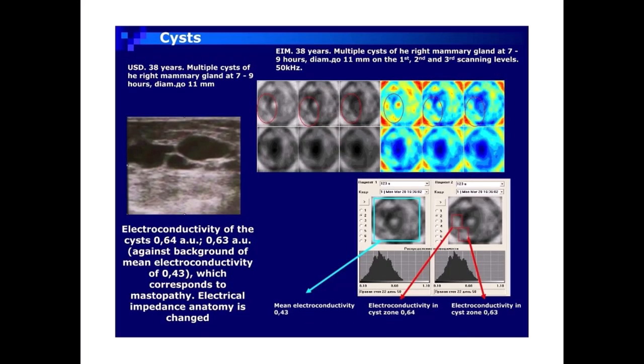Cysts EIM case: 38 years. Multiple cysts of the right mammary gland at 7–9 hours, Di-AM 11 mm, shown on the first, second, and third scanning levels at 50 kHz. Ultrasound: 38 years, multiple cysts of the right mammary gland at 7–9 hours, Di-AM 11 mm. Electroconductivity of the cysts: 0.64 AU and 0.63 AU, against a background of mean electroconductivity of 0.43, which corresponds to mastopathy. Electrical impedance anatomy is changed. Mean electroconductivity 0.43; electroconductivity in cysts: 0.64 and 0.63.